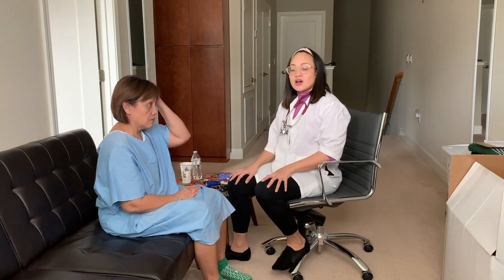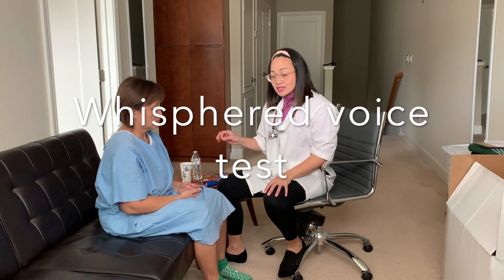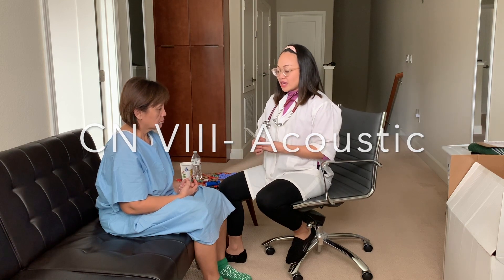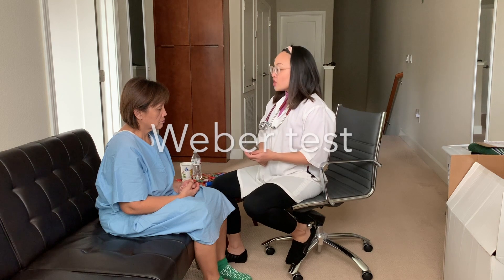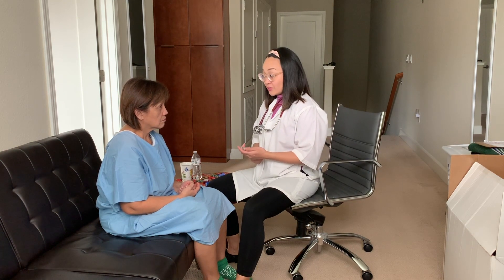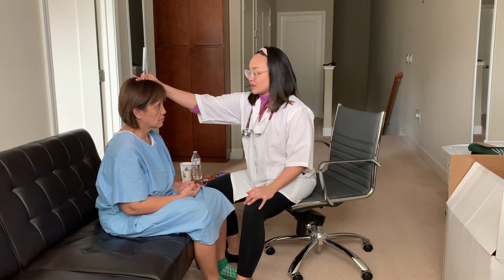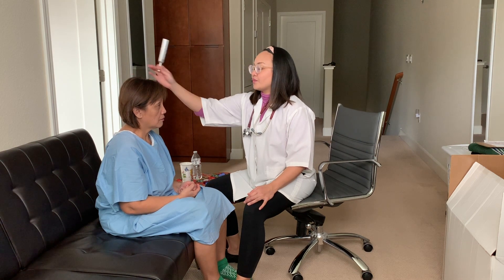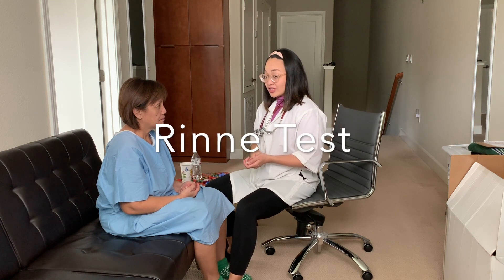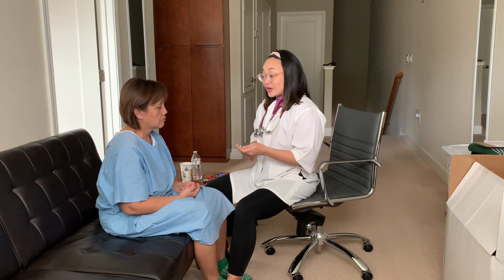If audiometric testing wasn't done, I would have done a whispered voice test, and if she fails that, I will do the Weber and Rinne tests. The Weber test listens for lateralization — you let me know if you hear it on both sides or only one side. One side or both sides? Both. And if she fails that, I would move on to the Rinne test, which checks for air conduction and bone conduction. You'll let me know when the ringing stops.